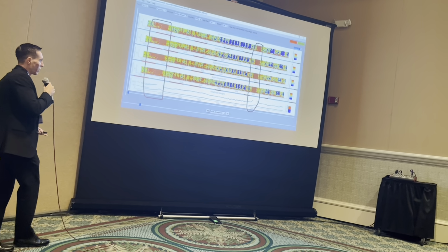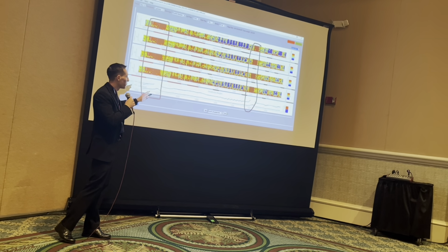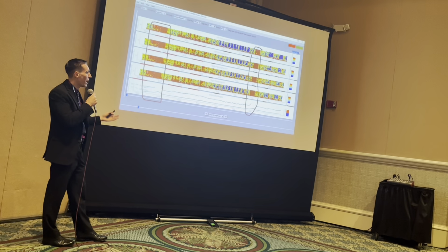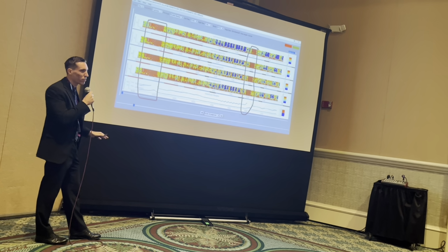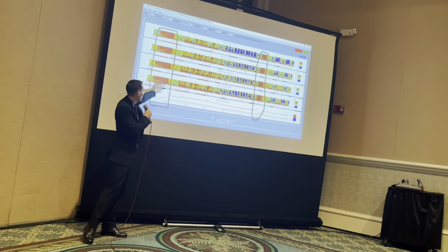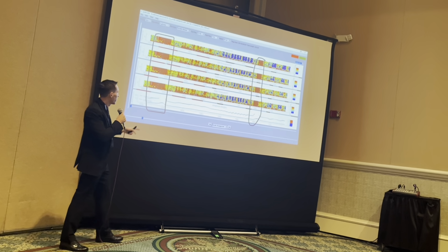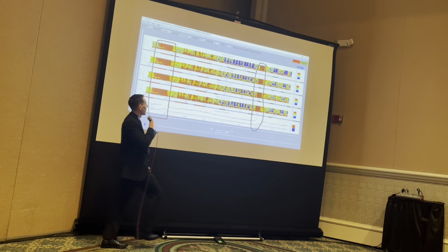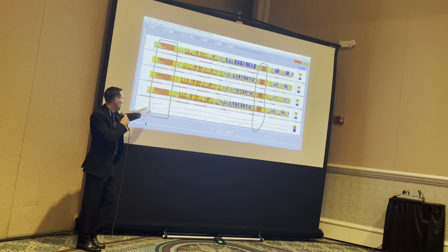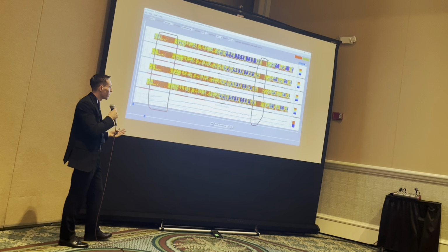Now, this is an interesting example because this one is filled with a ton of artifact, so it's really hard to see anything that's going on. There's really no clear place to count the background rhythm on this one because there's so much artifact. But there are two distinct areas where it looks like there's a flame, like I was talking about earlier. Seizures are represented by flames. We've got one here, and we've got one here. And not only do we have the flames on the frequency graphs, the amplitude increases like you would think in a seizure.